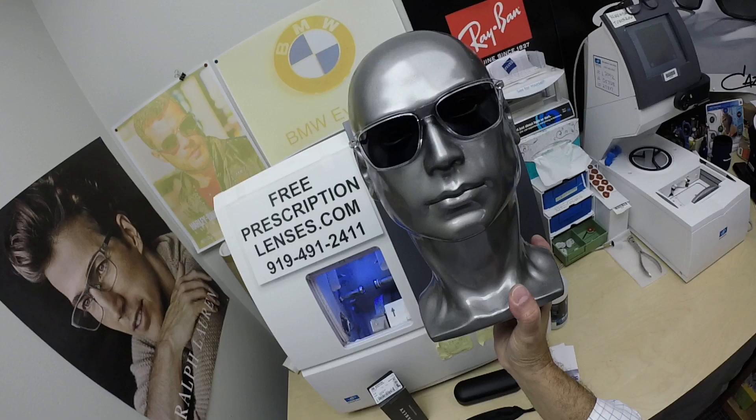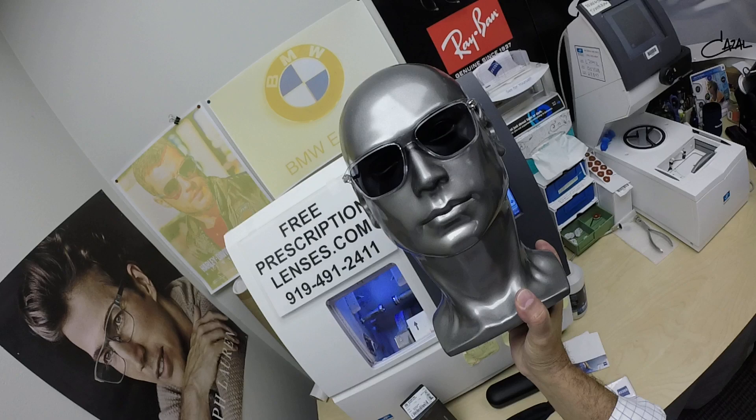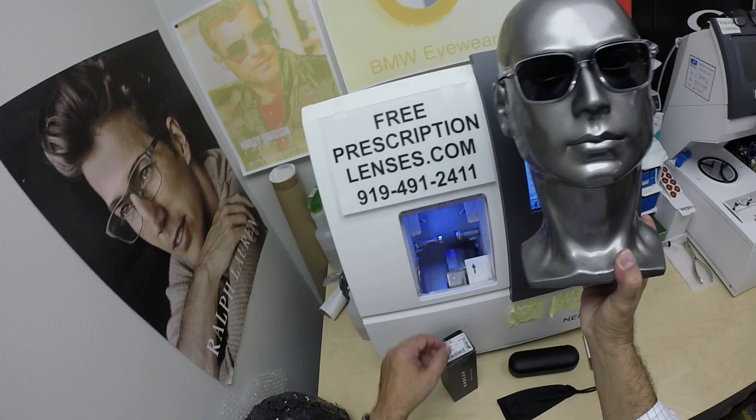The nice thing about photochromic lenses, but especially from Zeiss — the regular Zeiss Photofusion Gray, Brown, Green, and Blue block 30 to 50% of the harmful blue light emitted from today's electronic devices. This is the Photofusion Extra Gray, which blocks 50 to 70% of the harmful blue light. So you don't have to worry about that anymore.